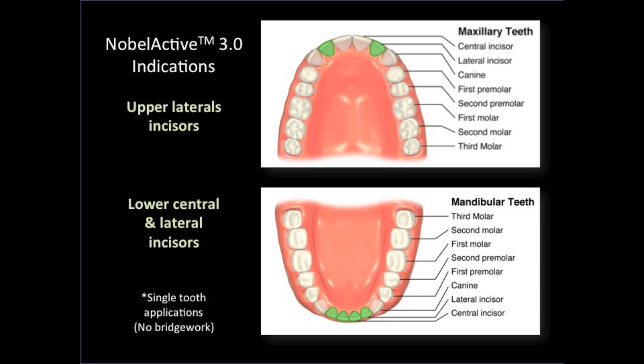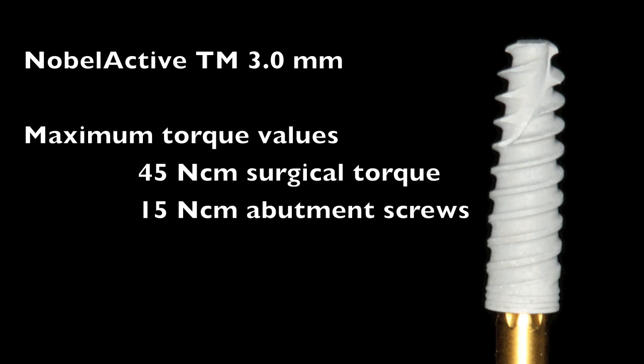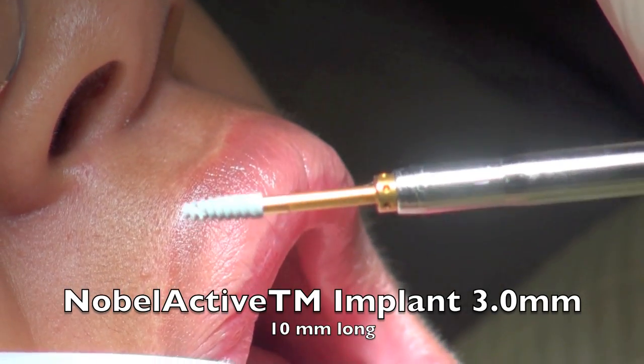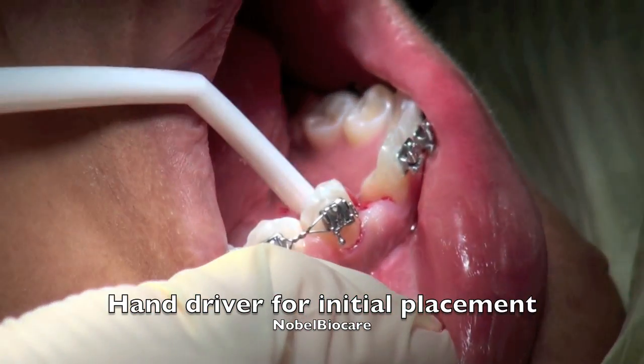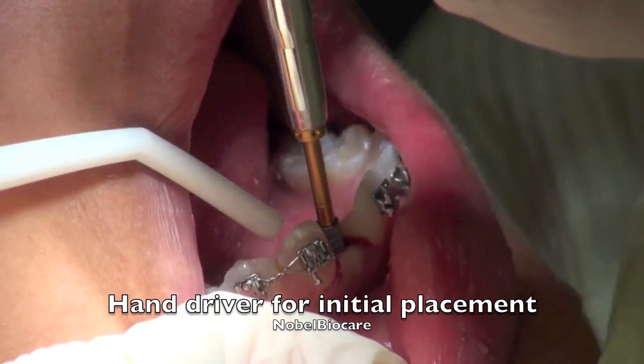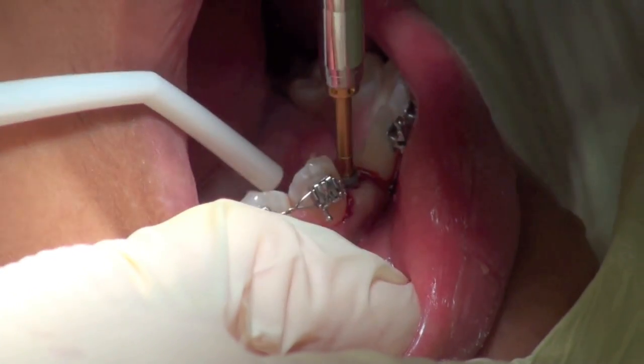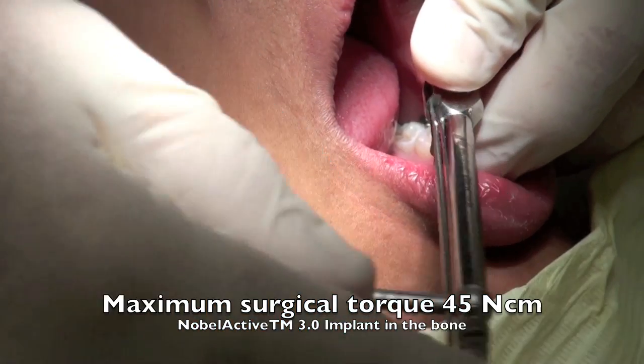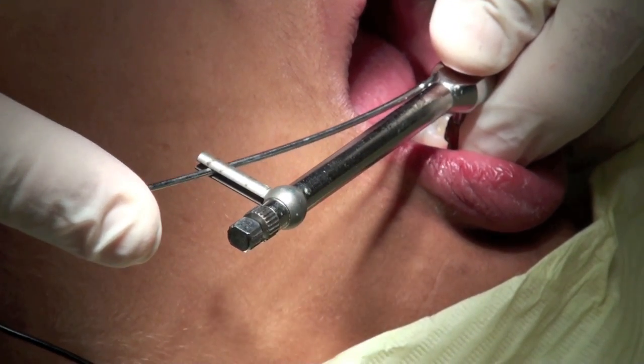According to the manufacturer, the 3.0 NobelActive implant is only indicated in three tooth positions: first the upper lateral incisor position, and then also the lower central and lateral tooth positions. This is only applied in a single tooth application. The maximum torque for the implant is 45 Newton-centimeters at the surgical time of placement, and for prosthetics it's 15 Newton-centimeters for screws. For today's case we're placing a NobelActive 3.0, 10 millimeter long implant — perfect for this thin ridge where we don't want to get too close at the apex. As we place this implant using a surgical driver, we have to be careful not to generate too much force, with a maximum surgical torque of 45 Newton-centimeters.